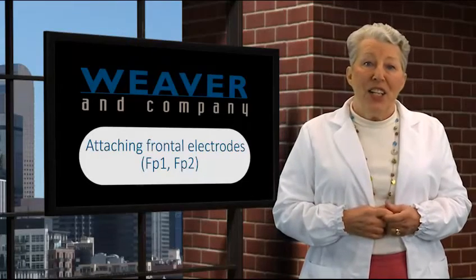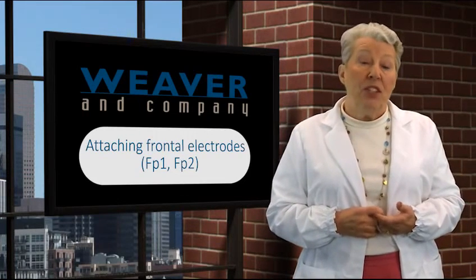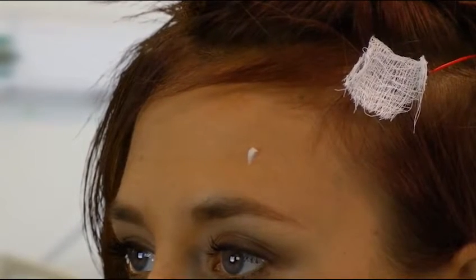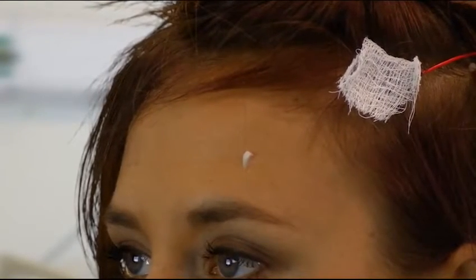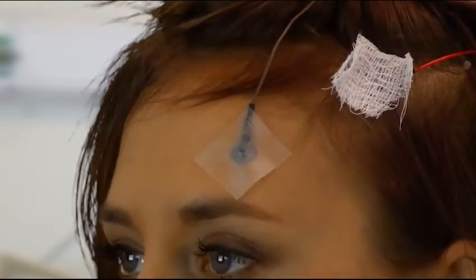Now let's take a look at those electrodes that are not in the hair but are on bare skin. The forehead is an example, but this also applies to patients with bald spots on their scalp. FP1, FP2, and any other positions where there's no hair — skin prep and application are the same. This works fine for bald patients. The only difference is that tape is used to cover the electrode rather than a gauze square.